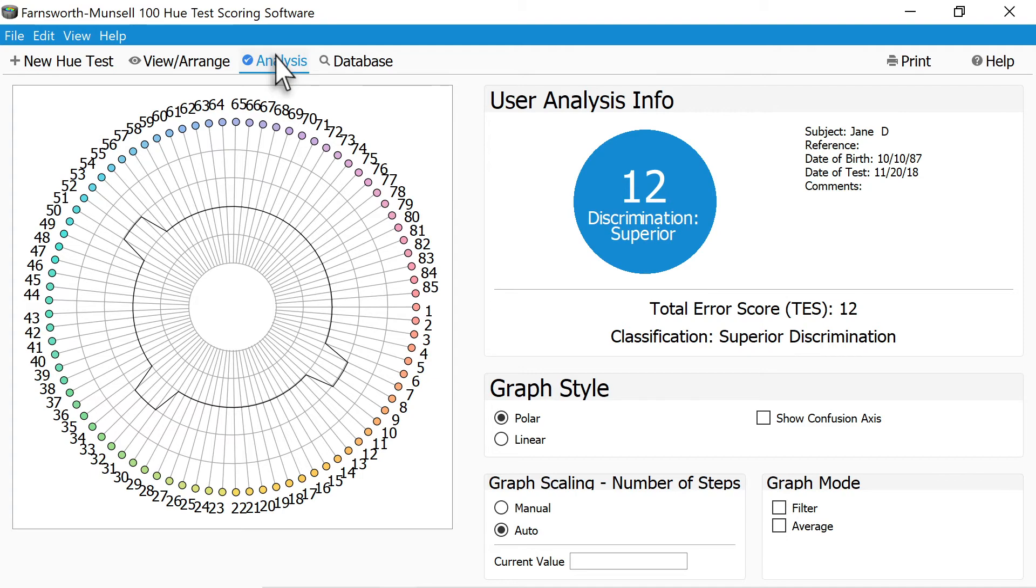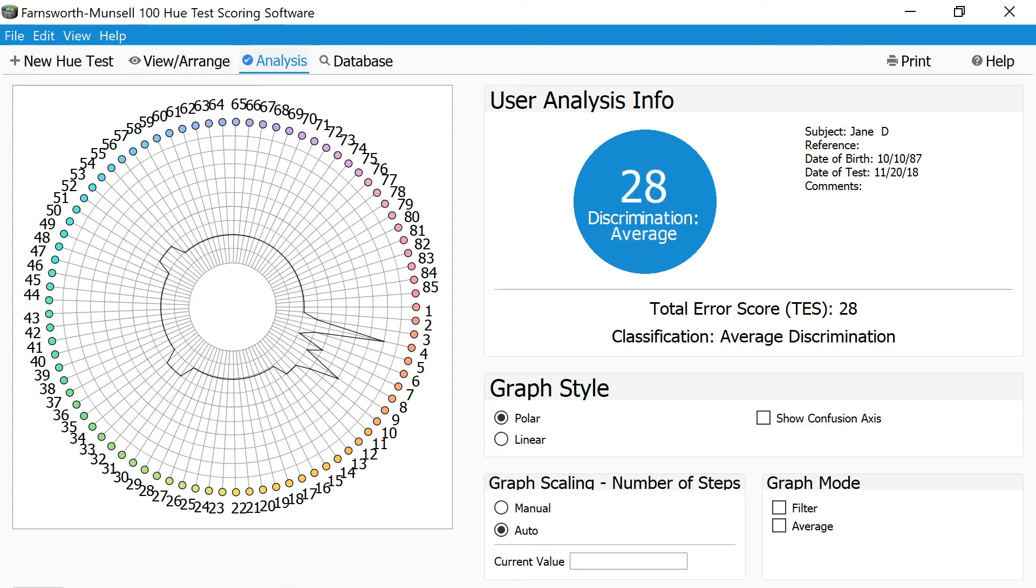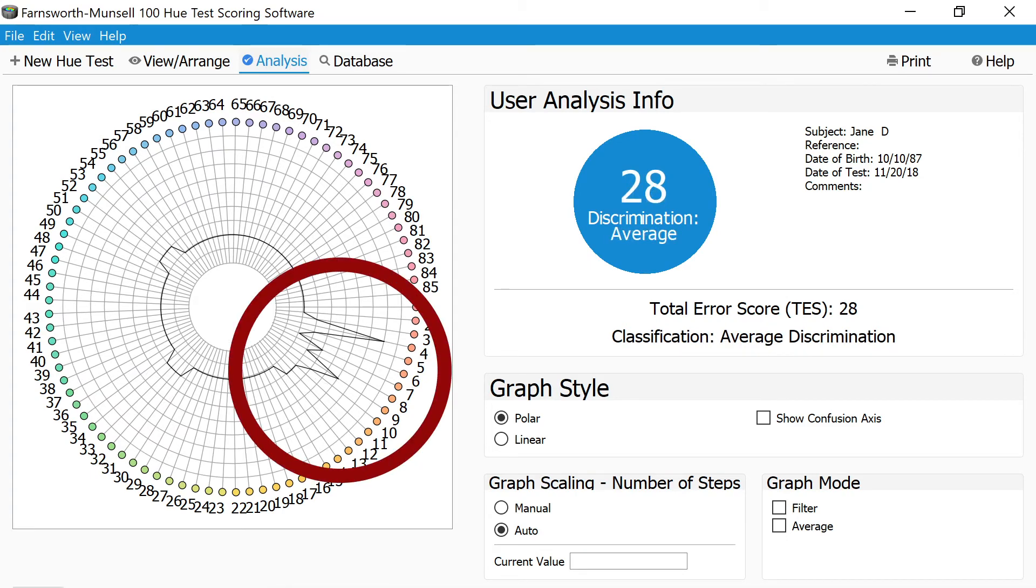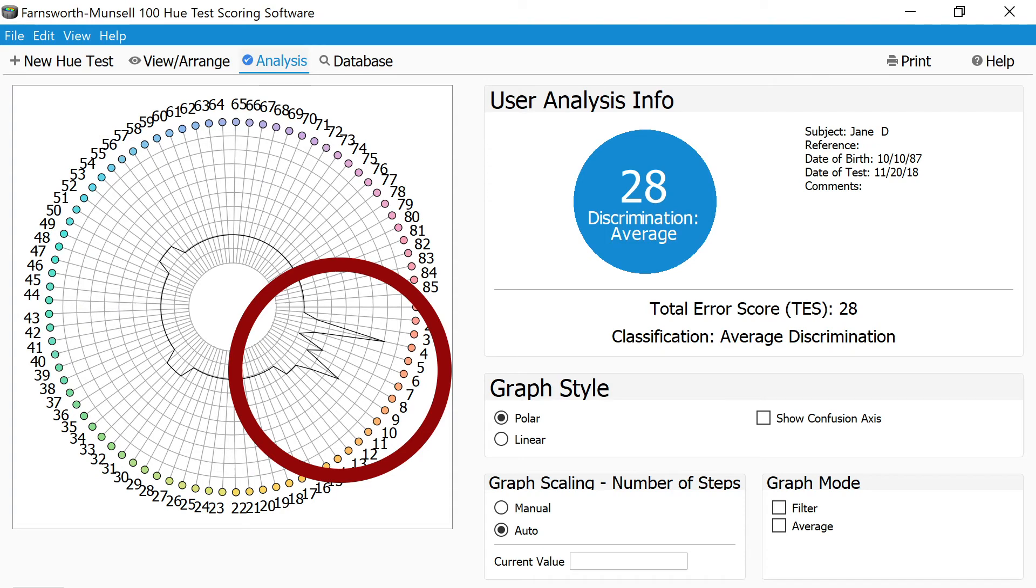When interpreting the results of the test, if you notice that there are high spikes or anomalies in any of the color regions on the graph, this is showing areas where the individual had weaknesses in being able to discern subtle color differences in that color region.